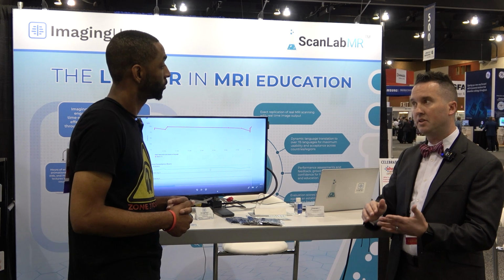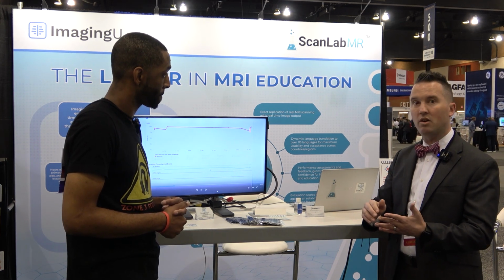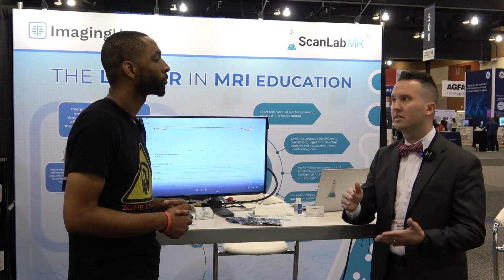If you ever do Alzheimer's studies, what we're doing is checking how effective a drug is in terms of brain size and that kind of thing. One of the big things that no one talks about is that consistency, that angulation, because right now somebody builds a protocol and sends it away, and they haven't accounted for the 9 techs that are going to be scanning any one of those patients at any time of day.